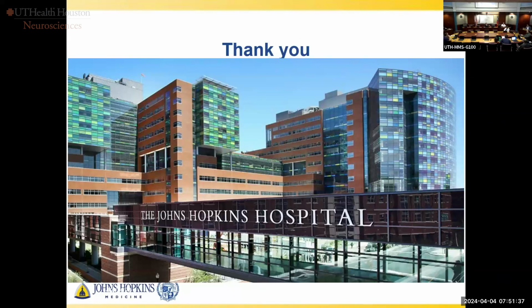You can skive the bone and the camera will show you that. The robotic arm is very strong. It'll just push the bone out of the way and it looks like it's going right in the pedicle on the image, but it's not. And somebody like Nick Theodore can figure that out. Some people can't. So it's a well taken point, and we'll see where it goes.